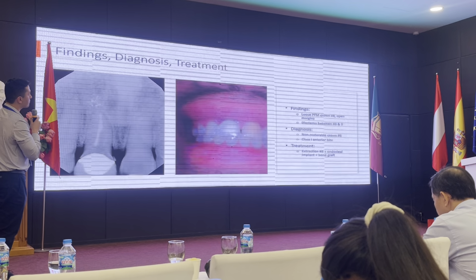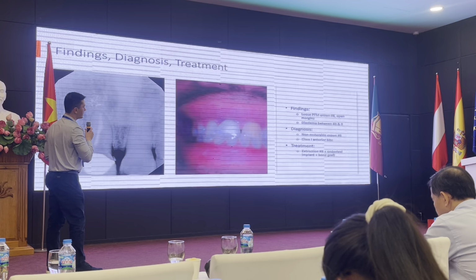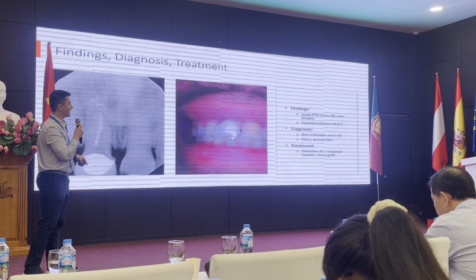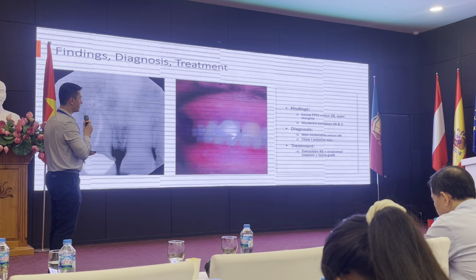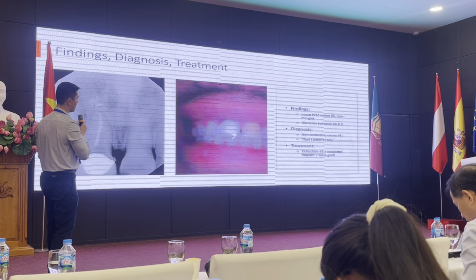Preoperatively, that tooth is a lot wider than the neighboring front tooth, so we know there are some pre-existing spacing issues here. But he's not concerned about how that tooth is wider than the other one. His main concern is that this tooth is loose, and he wants it fixed. He wants to replace it.